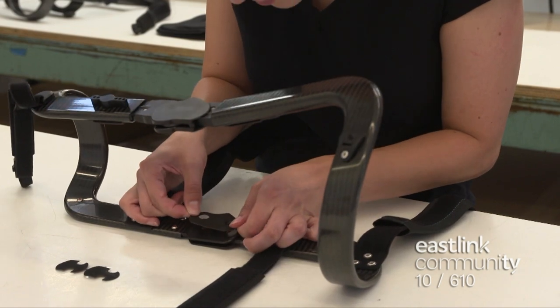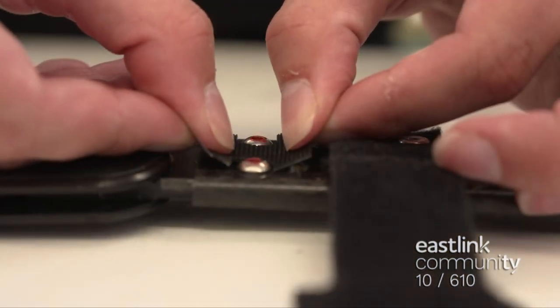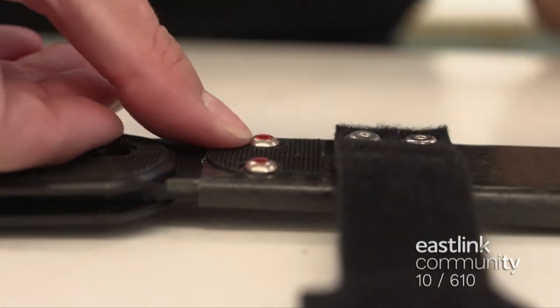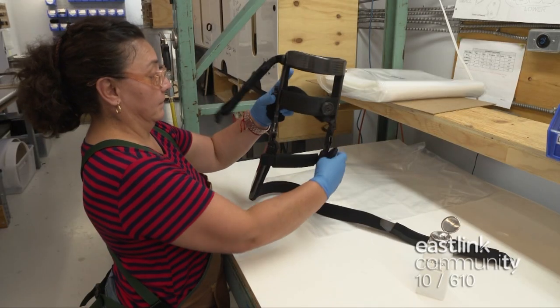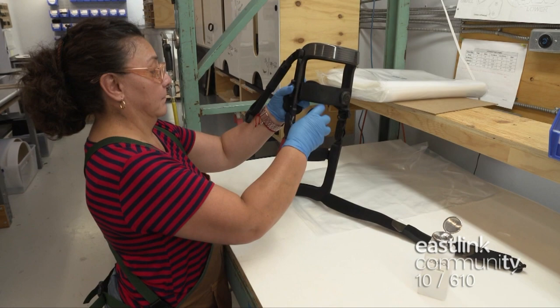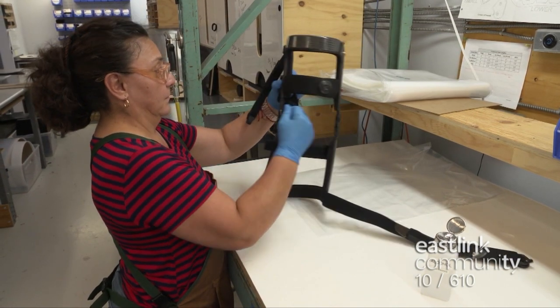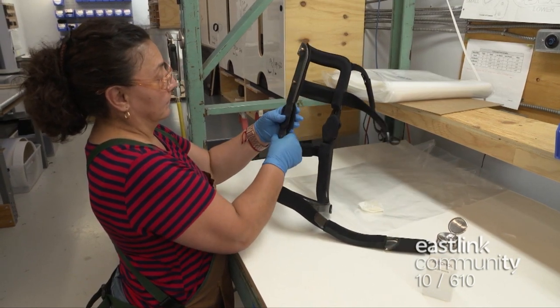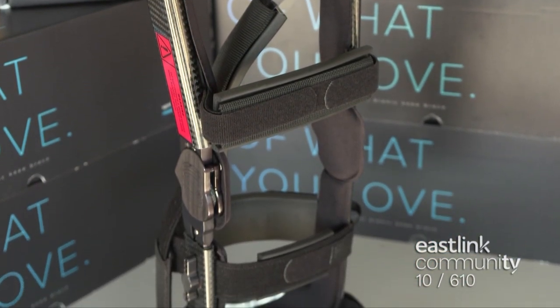At the final assembly stage, the brace is ready for padding and strapping. Velcro is attached throughout the inside of the brace, then it's wiped down. The underside of the padding acts as the hook for the Velcro to firmly hold the padding in place. Every part of the brace that touches the skin is covered in soft padding. Spring Loaded Technology ships its braces all over Canada and the United States to customers with a wide range of needs.